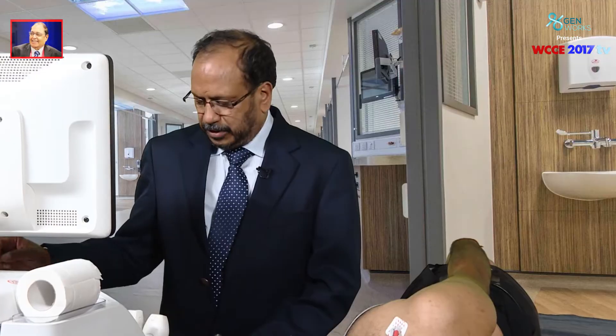We are going to talk about evaluation of echo in aortic stenosis — what echocardiographic images we should take and what parameters we should evaluate so that we come to a perfect conclusion. That's what we are going to show you in this series of echo training programs. The first parameters we take in this subject population start with M-mode.